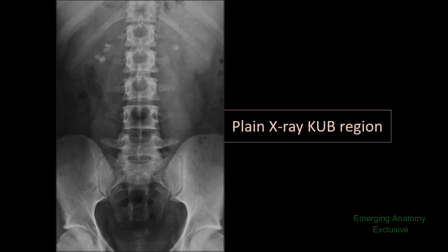This X-ray is taken on AP view — anterior-posterior view. Before going to find out the positions of the kidney, ureter, and urinary bladder, we will go for some identifications. Already you have known that these are the shadows of ribs, and I think you are also familiar with these structures. These are the bodies of the vertebrae.